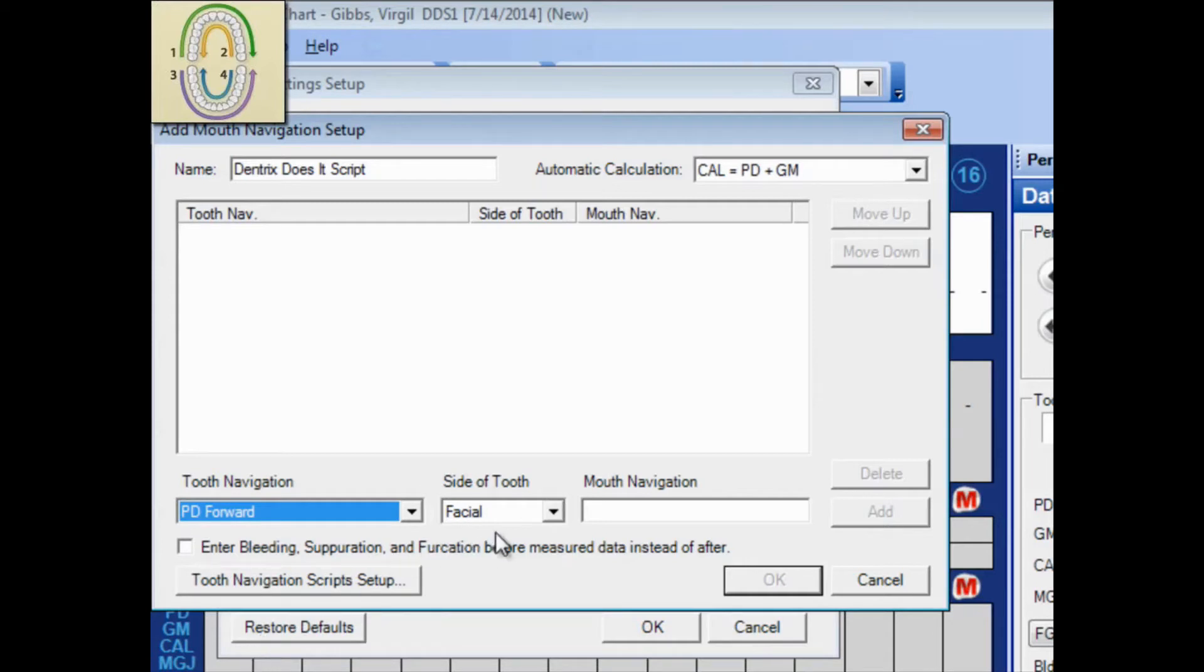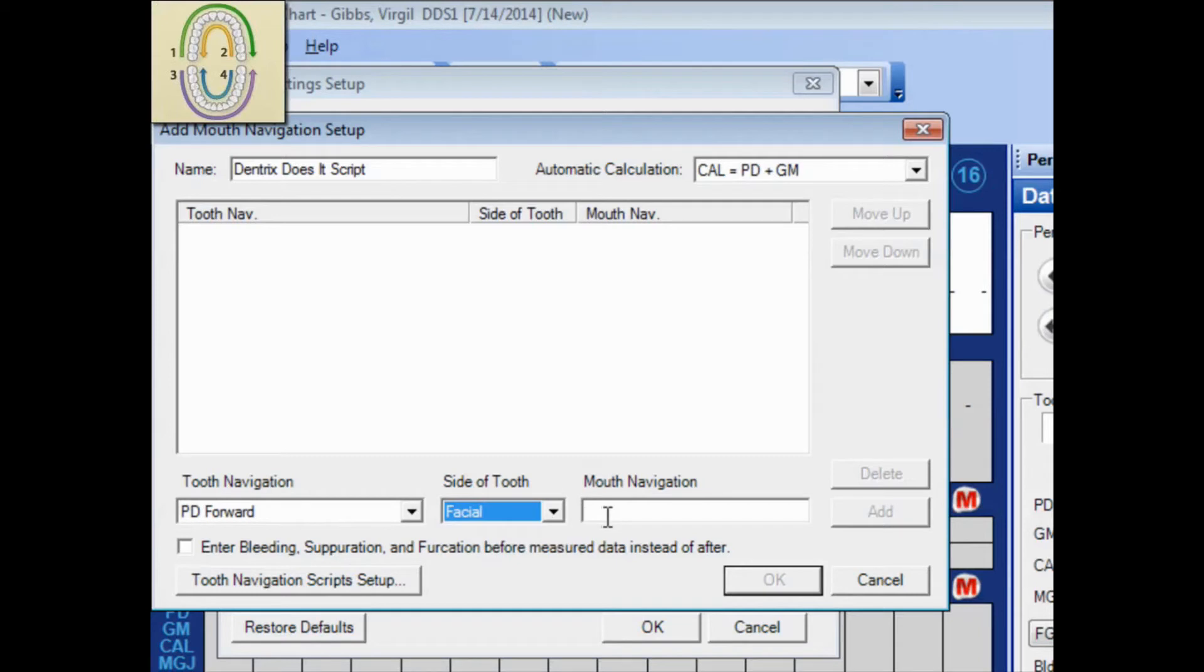I'm checking the facial side of the mouth. And I'm beginning with tooth number 1, and moving to tooth 16. And then click Add.